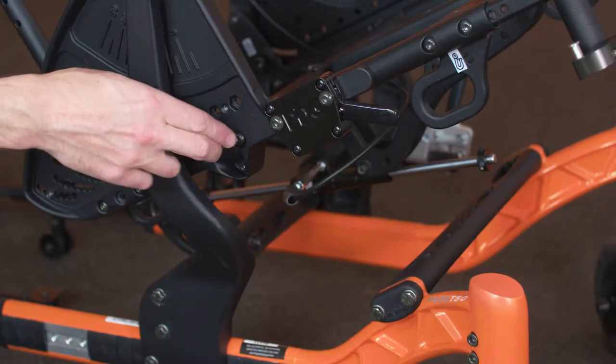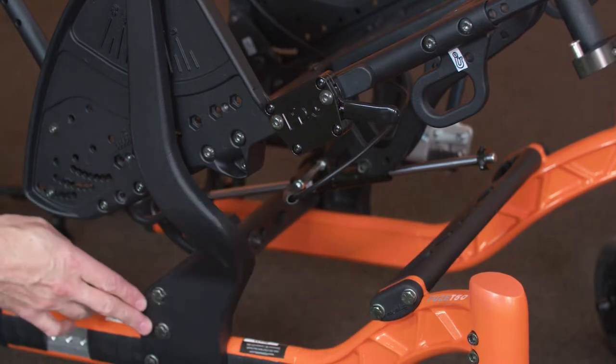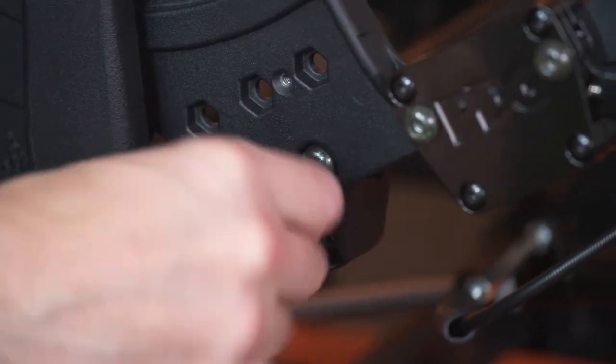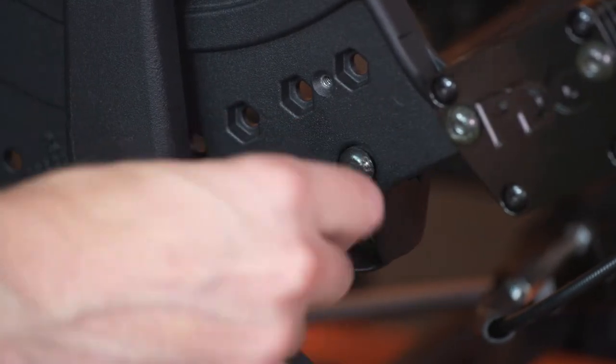Shown are the four locations of the crossbar mounting fasteners. Remove the mounting fasteners on one side of the chair, noting which fastener came from which location. This will completely detach the side of the wheelchair.